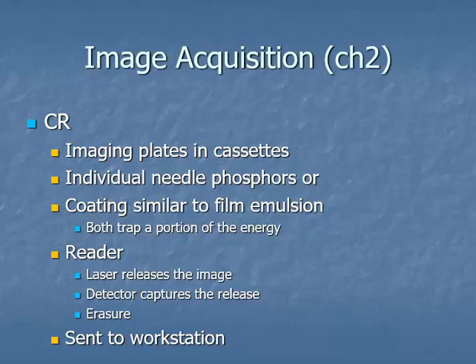If you remember, we had such a thing as ghost imaging. So ghost imaging was where our eraser bank was not adequately bright to release enough of that trapped energy inside of those phosphors to prevent us from having a residual image from previous exposure. So again, we would basically have a double exposure going on there.